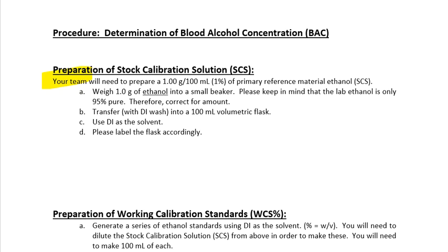I want you to do your own data analysis with the instrument. I want you to plot your own calibration curves. I want you to plot and solve for your own concentrations. I want you to answer the questions on your own. You're only helping each other when it comes to the sample preparation and the standard preparation, and that is it.